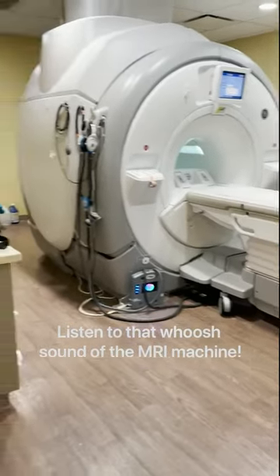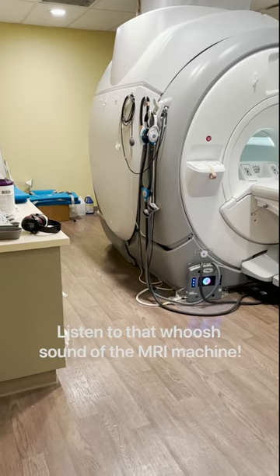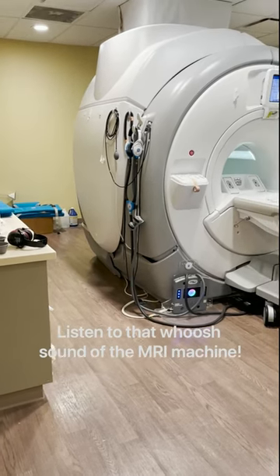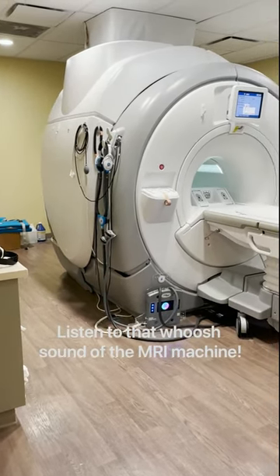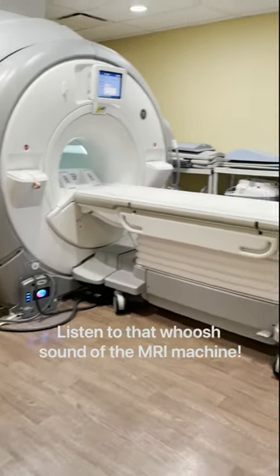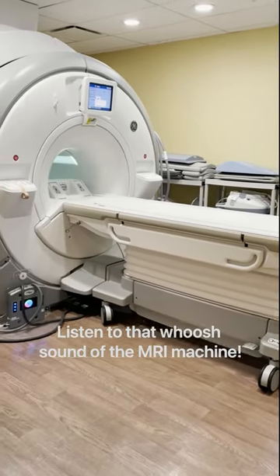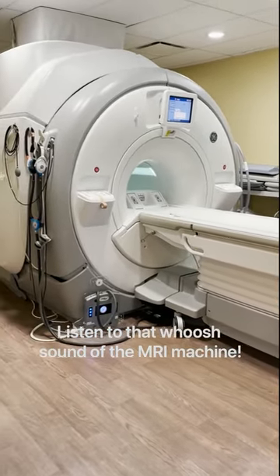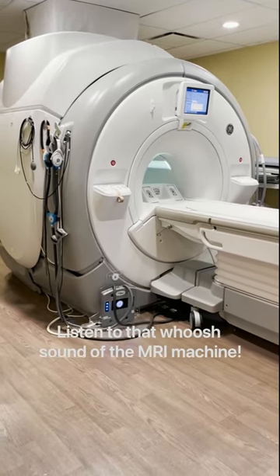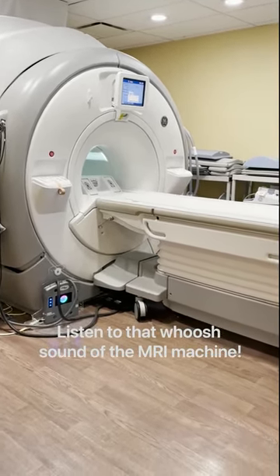So here we are in the MRI suite. MRIs are done using special machines that produce a magnetic field and radio waves to show very detailed pictures of your body parts and organs. There is no radiation at all when you get an MRI done. But because magnets are used to create the pictures, you should let your doctor know if you have any metal in your body, such as a pacemaker or metal pins from a previous surgery.